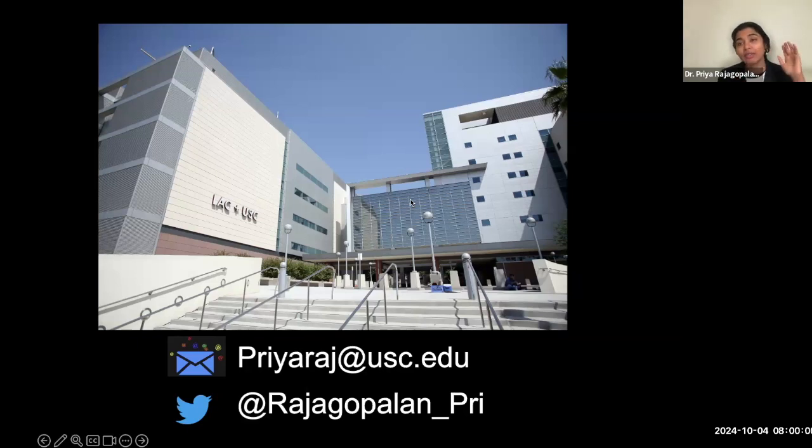And you try to see far back. So there are cases like this that commonly happen. There was a patient who had prostate cancer, and the CT scan showed a very sclerotic bone lesion. And our question was, is this actually a bone metastasis from the prostate cancer, or was this just a bone island to begin with in this patient?